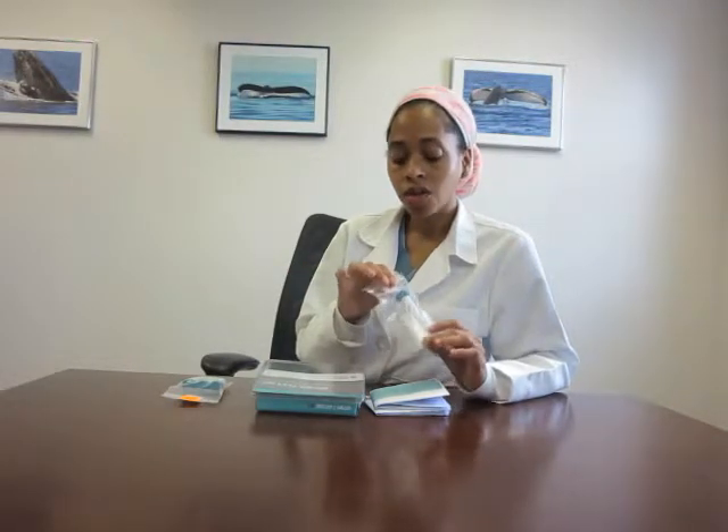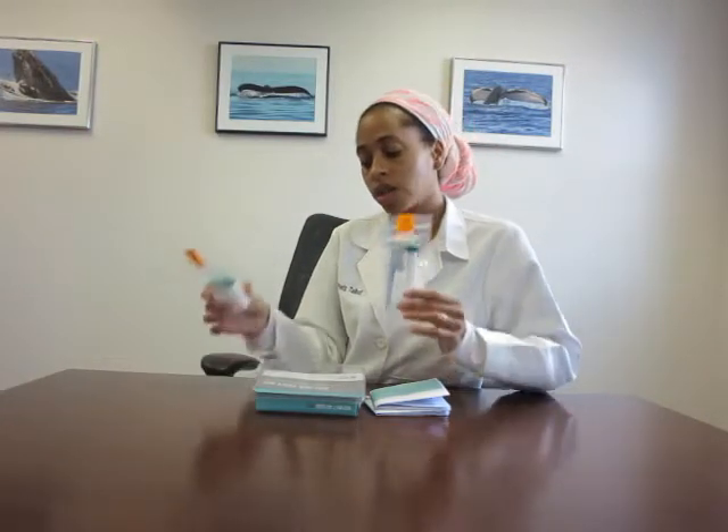Do not forget to label it with your name, the date, and the exact time that you finished your last spitting — that goes in here. Once you finish all the kits, then you can put them in here.